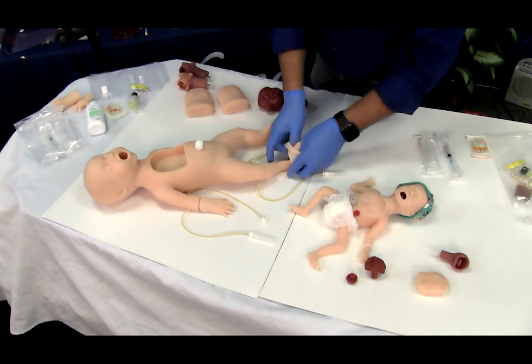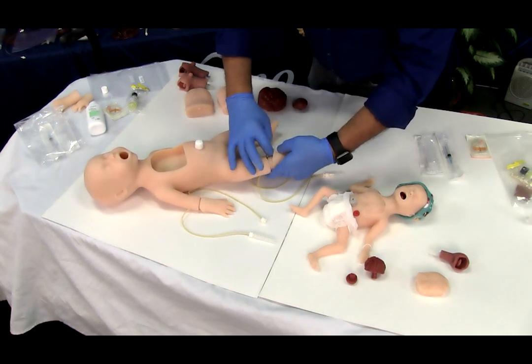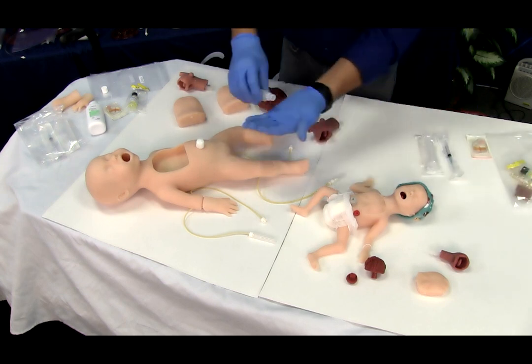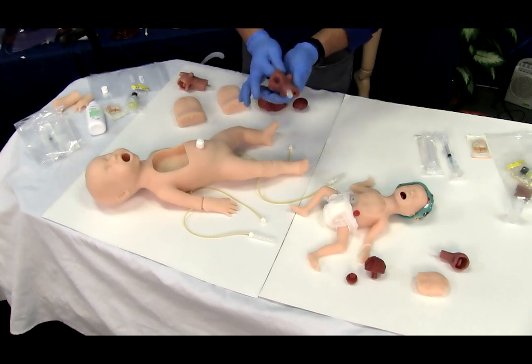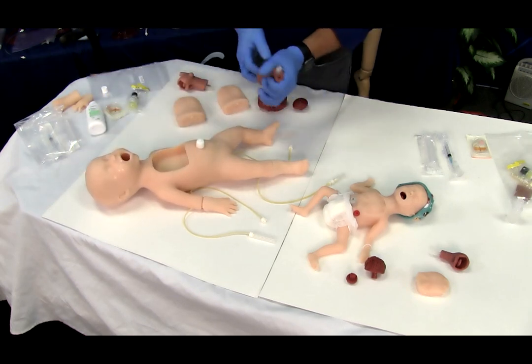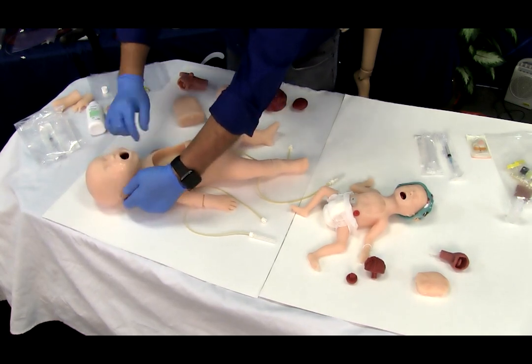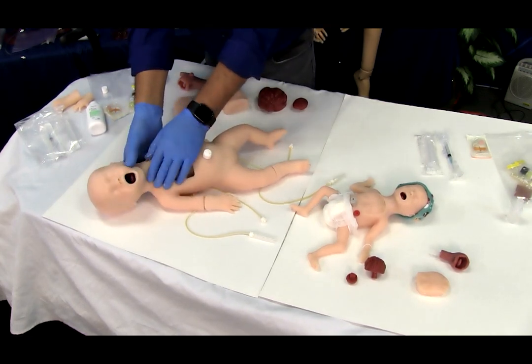To install the lungs and airway on both, thoroughly lubricate all outside surfaces, and that includes around the airway and around the baby's mouth. Gently insert your lubricated finger into the airway over the tongue and epiglottis. Push the tube end of the airway into the baby's mouth. Slide the airway down into the head. Make sure to free the baby's lips as it slides into place.